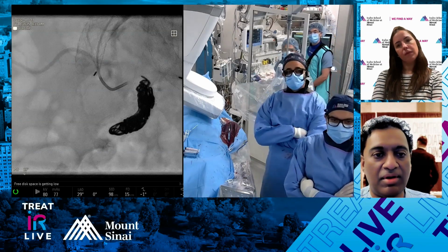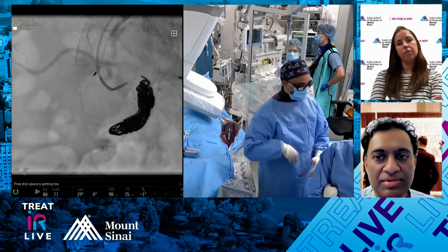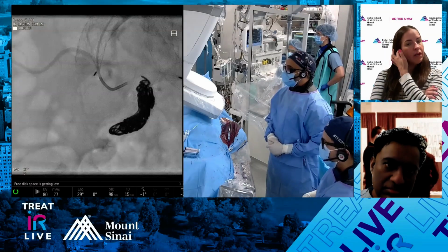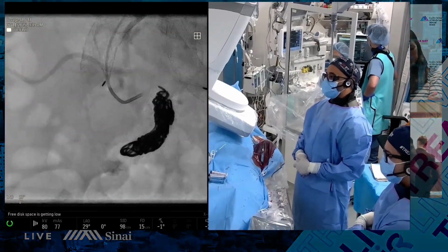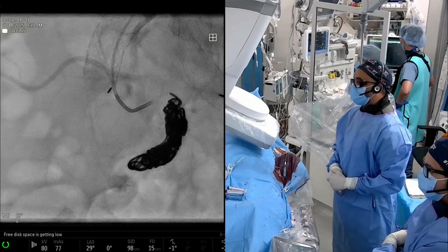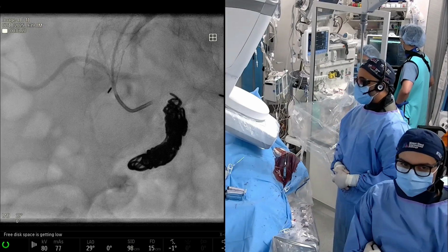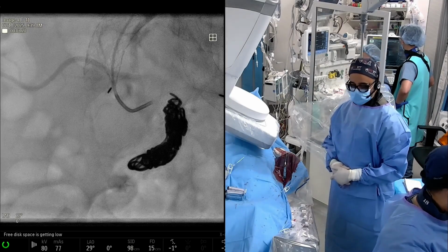Put a catheter and then stent and then Lantern, finish coiling. They have the Lantern. And then can I get a Fathom? Rahul, any thoughts? Yeah. So I kind of like that idea of just trapping it and then you can do whatever you want. You can also switch to liquid here if you wanted to. It's a little tricky, although hopefully it'll all get stuck in the coil pack. Usually we tend not to do that.